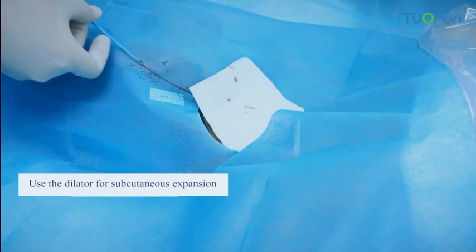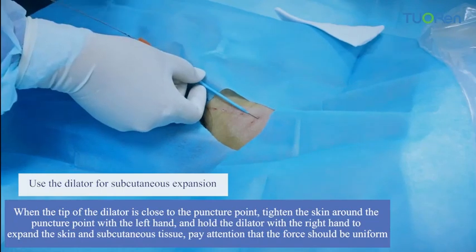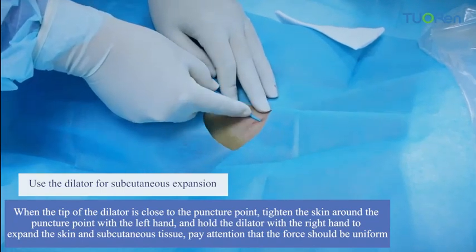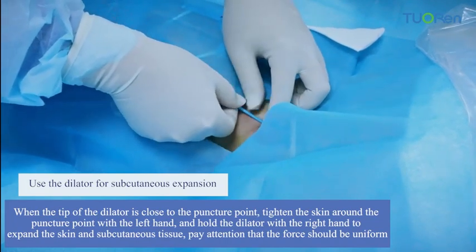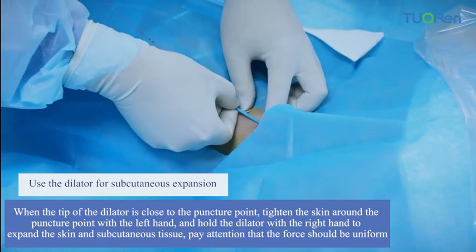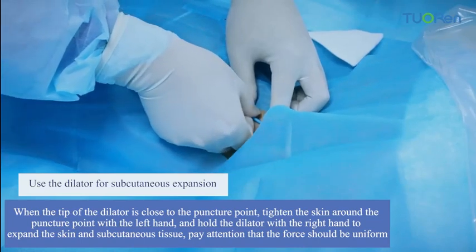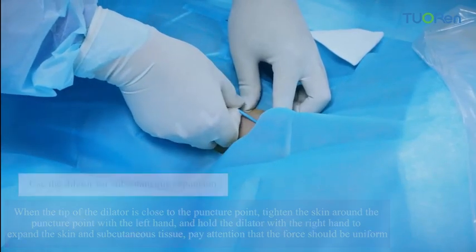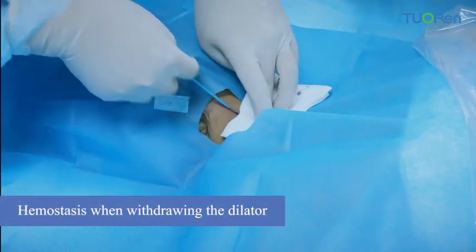Use a dilator for subcutaneous expansion when the tip of the dilator is close to the puncture point. Tighten the skin around the puncture point with the left hand and hold the dilator with the right hand to expand the skin and subcutaneous tissue. Pay attention that the force should be uniform. And hemostasis when withdrawing the dilator.